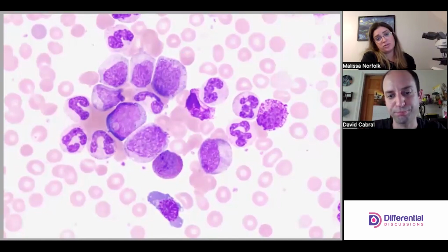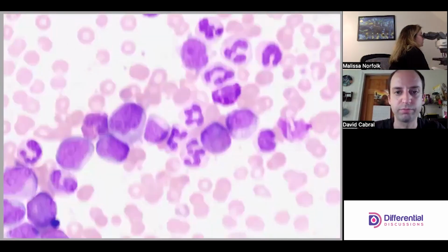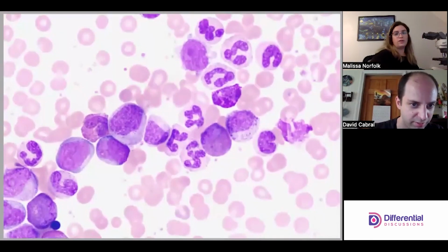And we will distinguish for you just because we want you, the audience, to be able to distinguish in case that's what you're here for. All right. We're going down, so let's go down. Oh, did we find it finally? I think we found it.